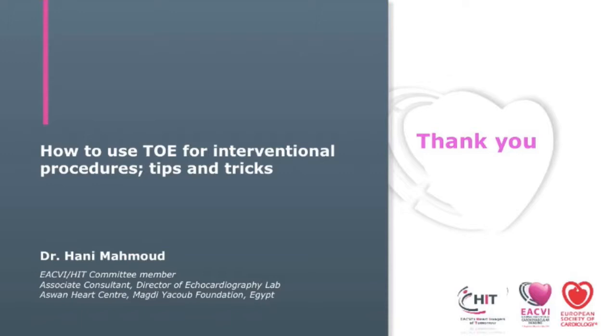I would like to conclude. We have seen 5 major topics of interventional use of TOE during procedures. We started with the mitral space, showing leaflet-to-leaflet therapy with the MitraClip, the most prevalent option in interventional procedures for mitral regurgitation. We then saw annuloplasty, a quite new procedure with less than 200 implants worldwide, but also using TOE very importantly during the procedure in the cath lab. You cannot do it without echo in the future.